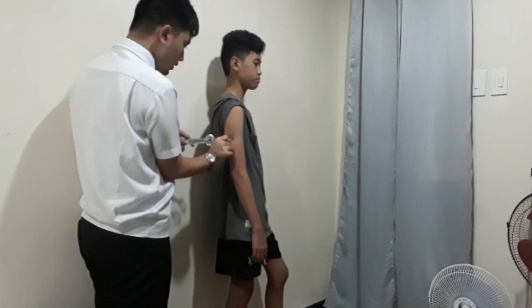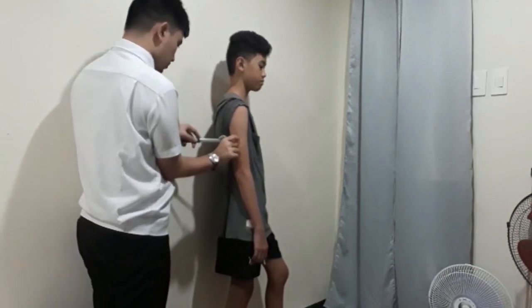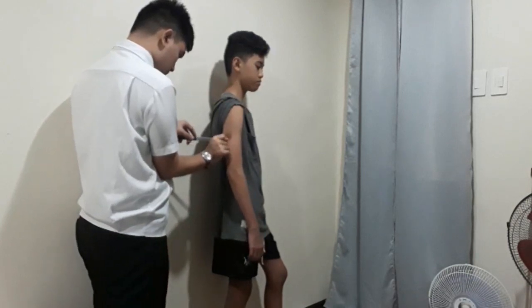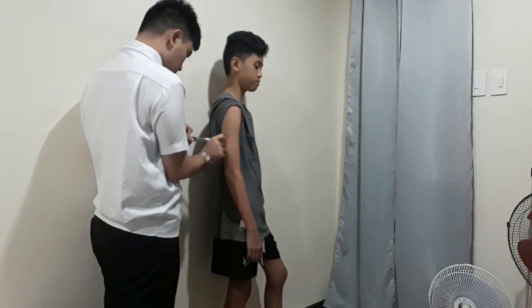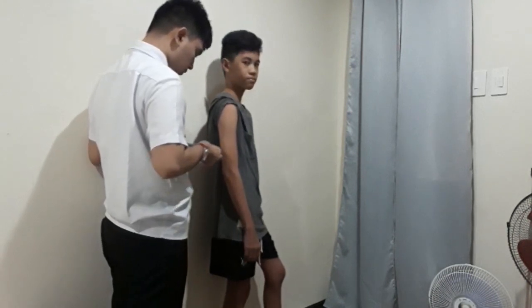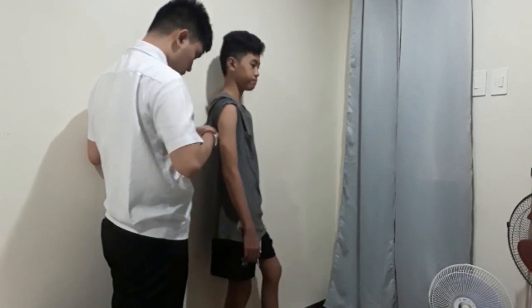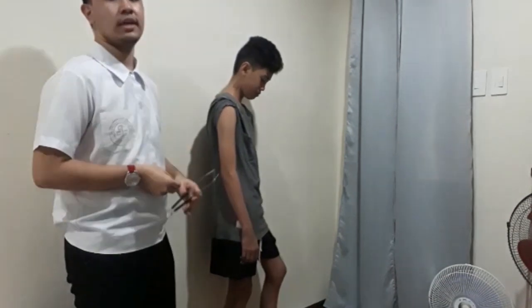So upon pinching it, we'll now use the caliper. Okay. So the measurement is 2 cm.